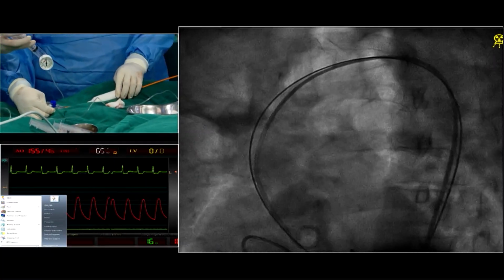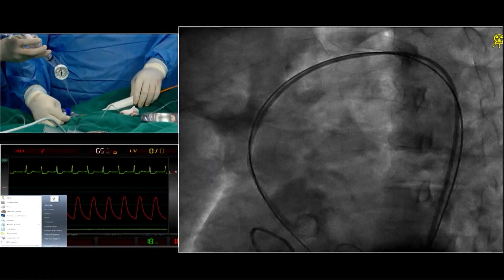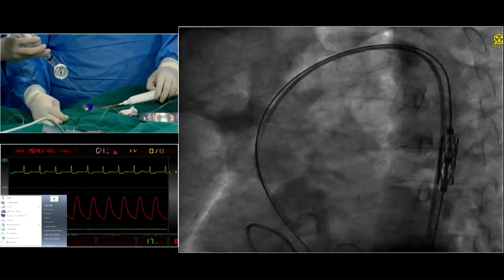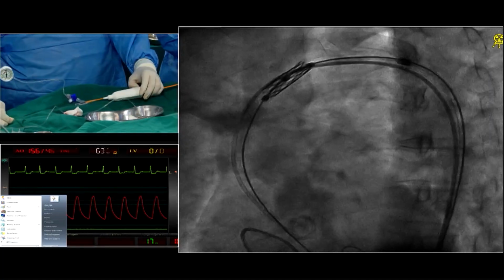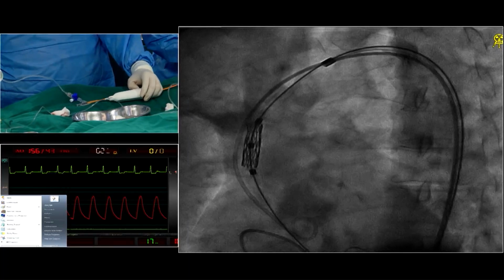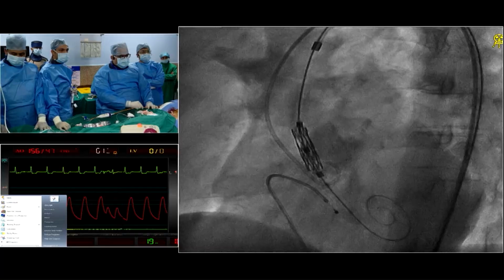Now we are going to navigate the aortic arc. I have already given flex and Dr. Sumit is going to push it in slowly. Good. Come down on inotropes if you are giving any. So it was a smooth transition, you can see enough. Alright, so we are going to push this valve inside now.